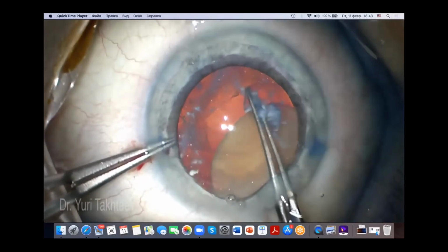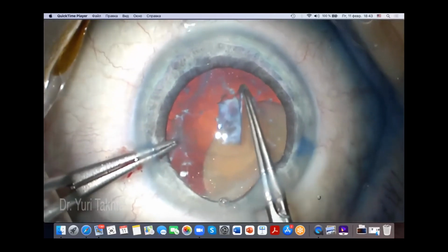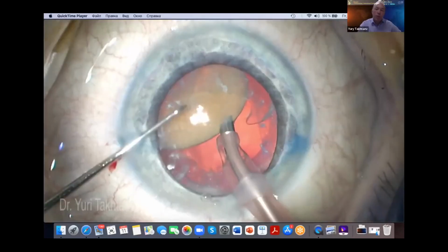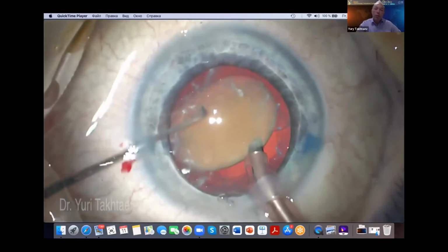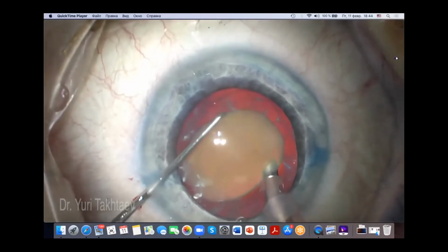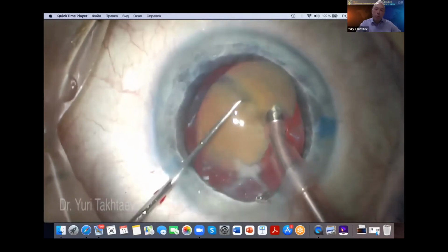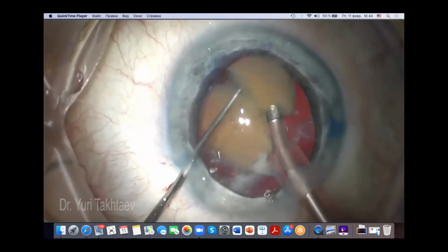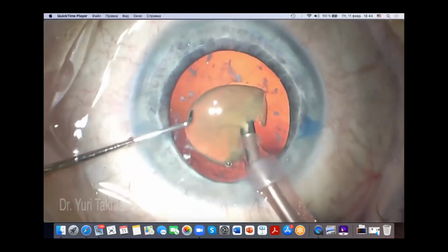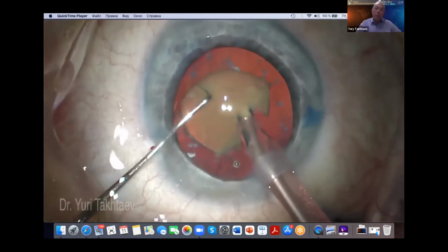This is the 5 mm rhexis. Before starting the rhexis, I put some viscoelastic in the capsular bag just to reestablish the capsule contour. And I start to separate the nucleus into two heminuclei and try to reduce my flow rate.